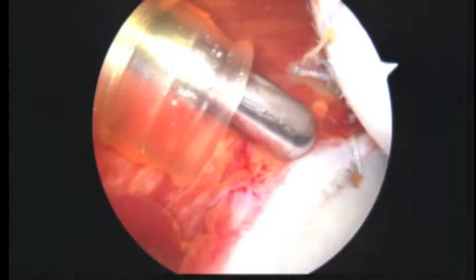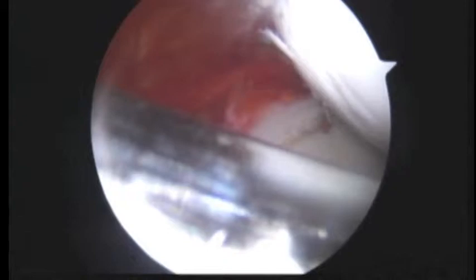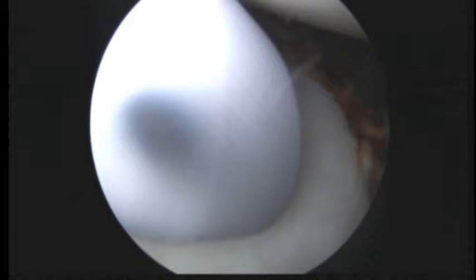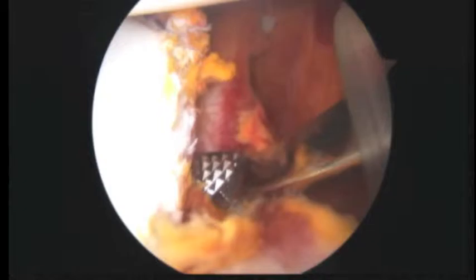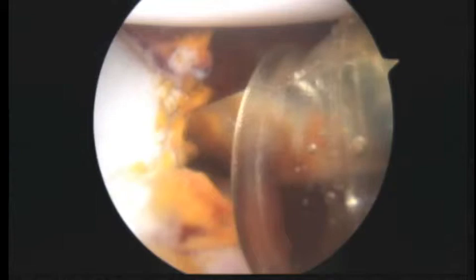We're going to back out the yellow cannula in the back and leave the camera in the same place. There's the gray cannula coming in the back. We're going to go ahead and reach down in the front and place our yellow cannula. We're using this instrument to help free up some of the soft tissues. Hopefully that will not be too difficult because this didn't happen too long ago — I can feel it loosening up a little bit.